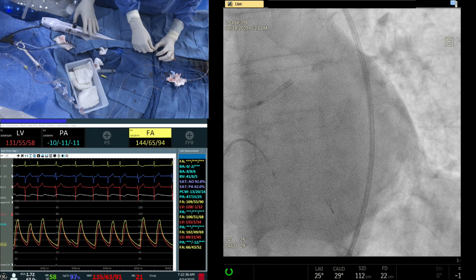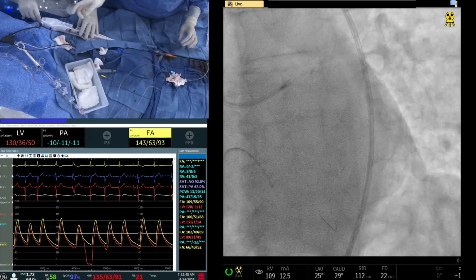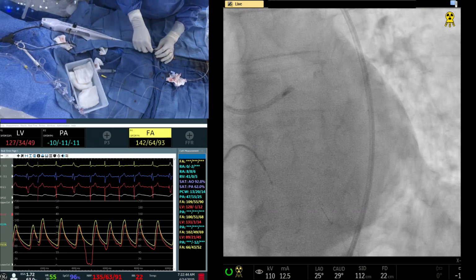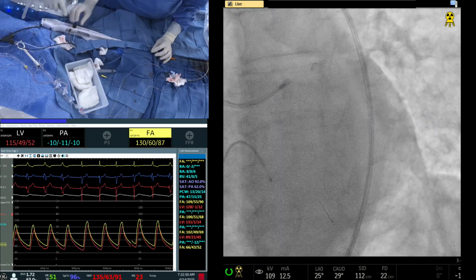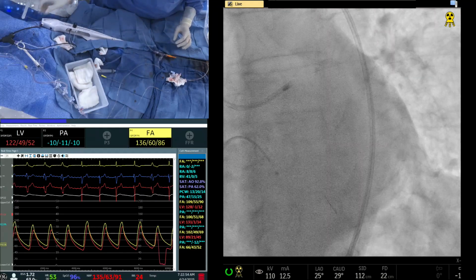Always you have to check outside. The machine is working, but what if the machine has some technical fault? We know that unfortunately, even in the best of the best planes, things can happen. So we always check it first. So these are 3 steps: moving forward, backward, and one on the Dynaglide, and it's ready now.